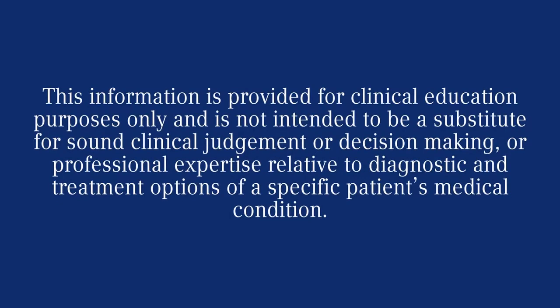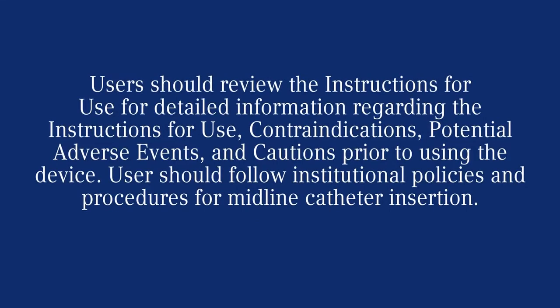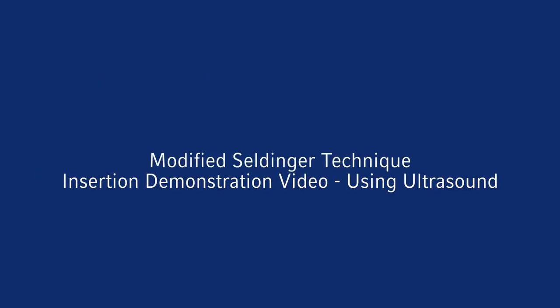Always read the catheter manufacturer's instructions for use and follow institutional policies and procedures for midline catheter insertion. The insertion depicted in this video is a representation of the modified Seldinger technique for insertion using ultrasound.